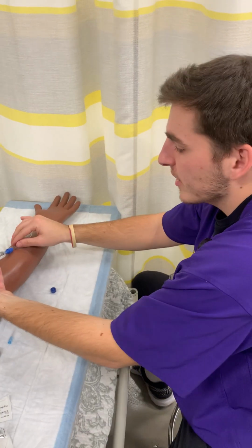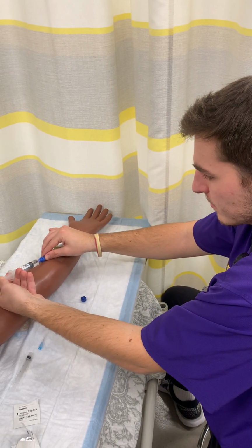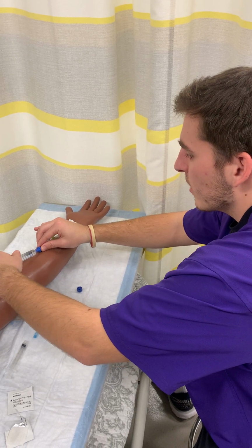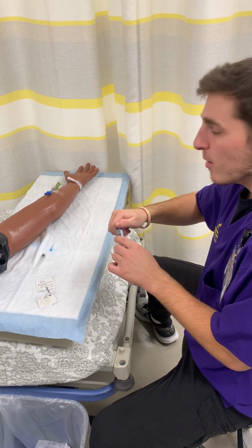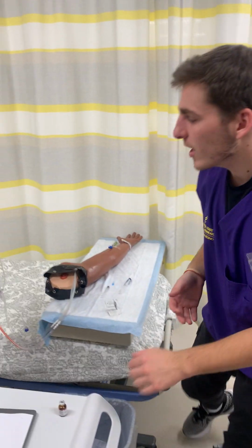Now I would give 3 milliliters. Your fluids up, and then your levofloxacin antibiotics. Now, I'm just going to clean this back, put this on. Now I'm just going to hook up your maintenance fluid and your levofloxacin for you.